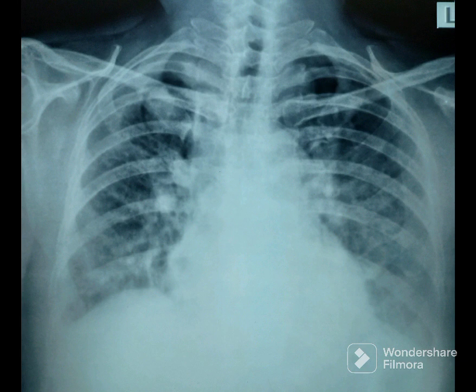A less obvious finding is in the right upper zone. Note a crescent of air below the middle half of the right clavicle. On close inspection, you may see a semi-lunar shaped air shadow with a thin stripe of air encasing a cavity, with the fungal ball within it. Aspergilloma.